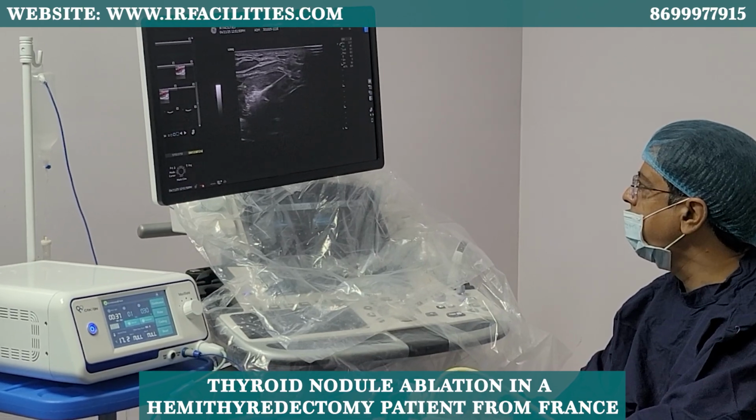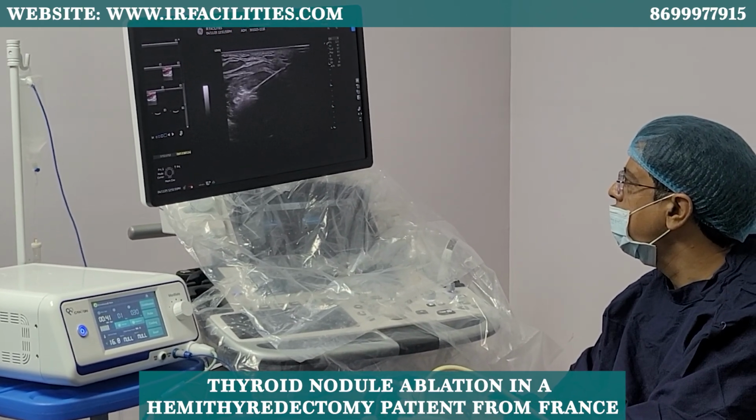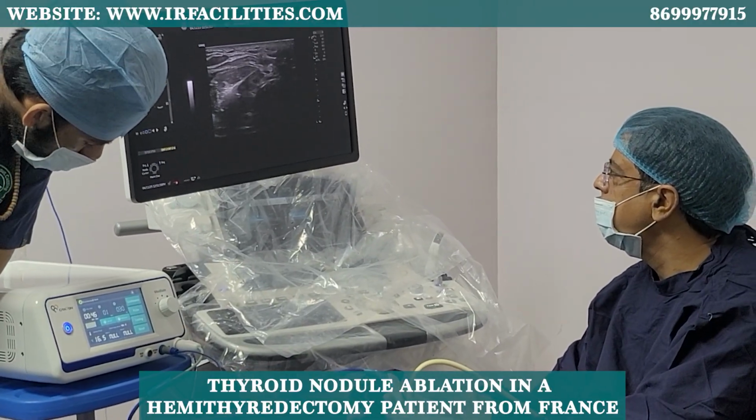You can hear crackles, right? Yeah. Tuck, tuck, tuck, tuck, tuck, like that. Yeah. So that's laser, okay? That's right. It's not doing any harm.